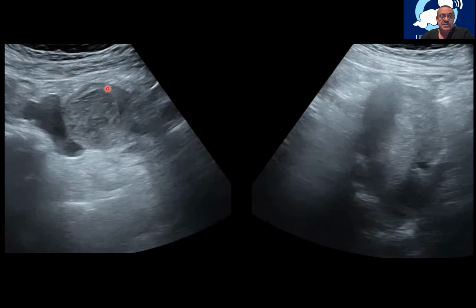This is a frozen image of what I called a while ago a complex ovary. This is not the regular image of an ovary. There are some echoes of medium intensity, some free fluid surrounding the ovary, probably inflammatory. And in the uterine view, we have a small collection here on the anterior wall of the isthmus. This is on the area of a previous cesarean section.